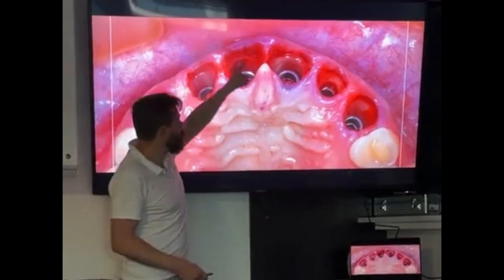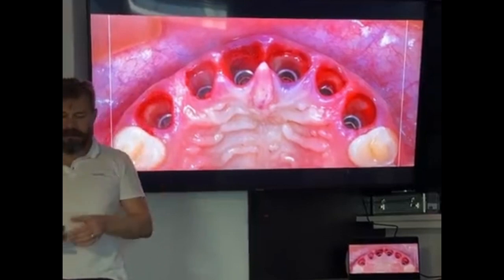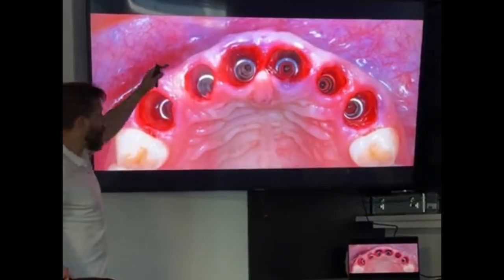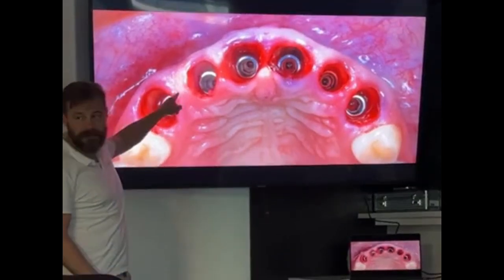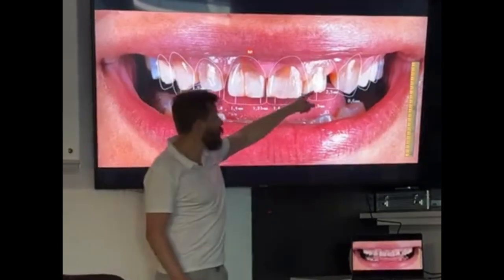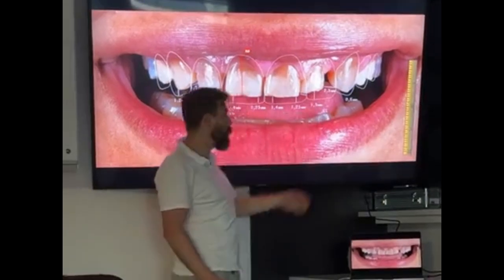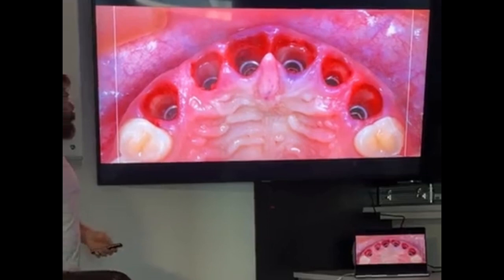And there is one root structure where the resorption was really large, so I needed to take everything out and place the implant with a palatal approach. You see here I have a huge diastema at this lateral incisor. We're going to close that, so my implant is pushed a little bit against the distal bone peak for me to fix it and to have a good distribution for this crown.